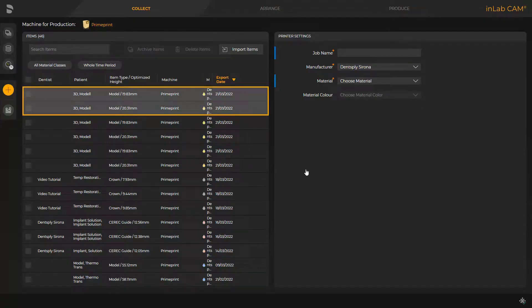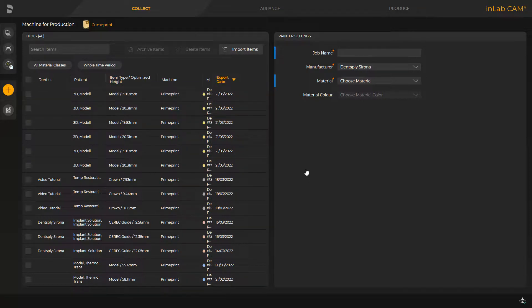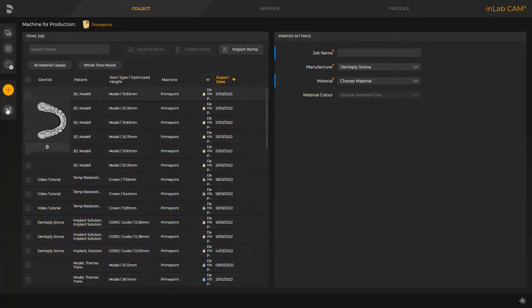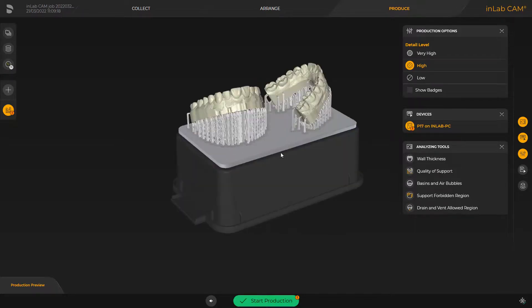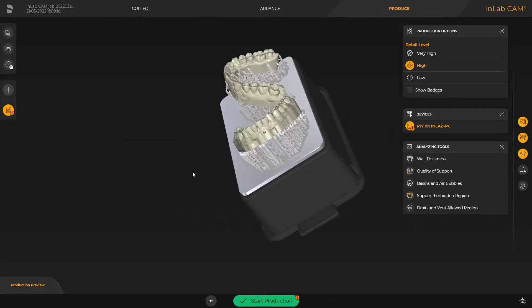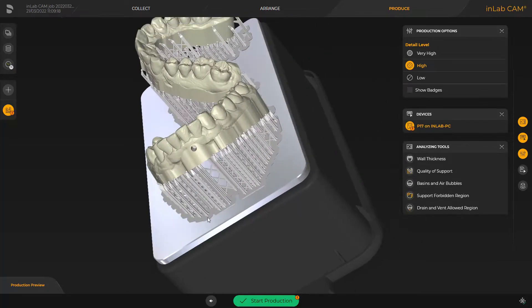Once both models are displayed in the InLab CAM software job list, we click the job icon on the very left side of the screen. By doing this, the job is directly transmitted to the produce phase. All steps and features of the arrange phase are performed automatically. Before starting the print process, we view both solid models from all directions. As can easily be seen here, the drains were also automatically determined.